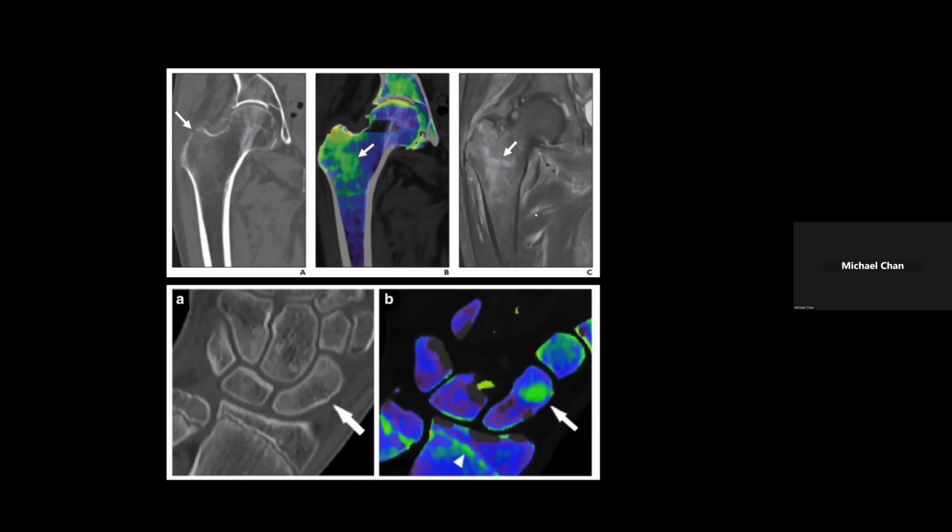this intertrochanteric fracture. And then here on the right, you have a T2 FATSAT image on MRI that basically shows you how accurate this bone marrow edema map is. It basically follows a similar distribution.